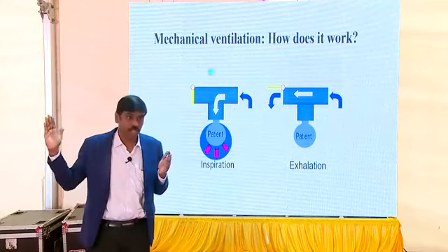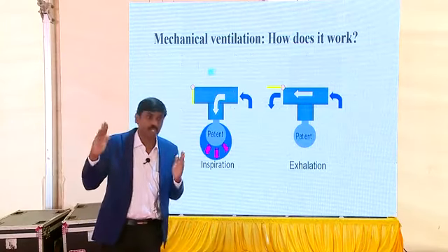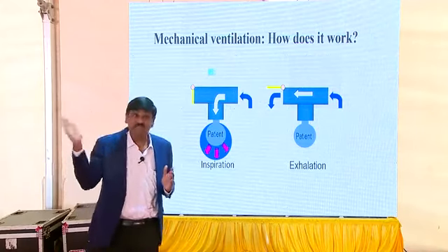That's going to be an inspiration. How long that valve remains closed will control the inspiration. Once the valve opens, the air is going to flow out. That's going to be an expiration. Now, how long is that valve going to remain open?